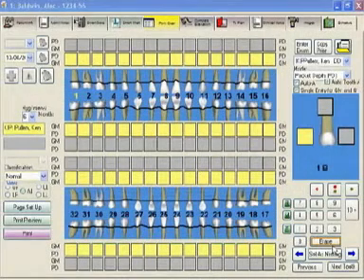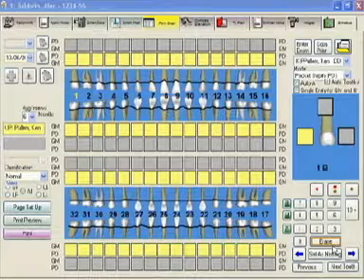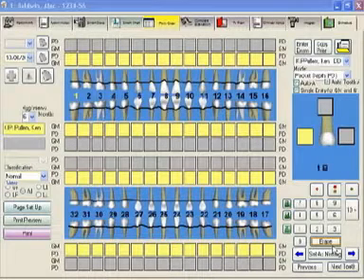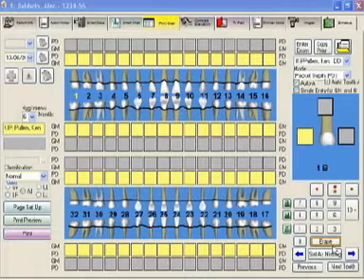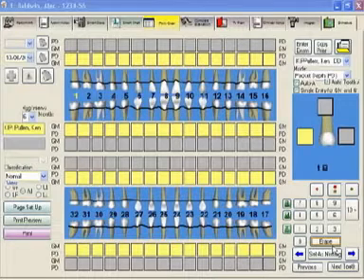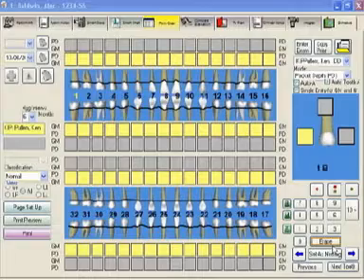This is the complete exam perio chart and you can choose to update the last perio chart by doing the copy prior or you can enter a whole new exam. I'm going to show you how to just do a whole new exam. The Dental Rat is just going to follow your set path with it and it's going to automatically advance tooth to tooth. And you can mark your bleeding and recession as needed as you're going along in one simple pass. So you just start by entering your numbers. These are your numbers across the middle here.